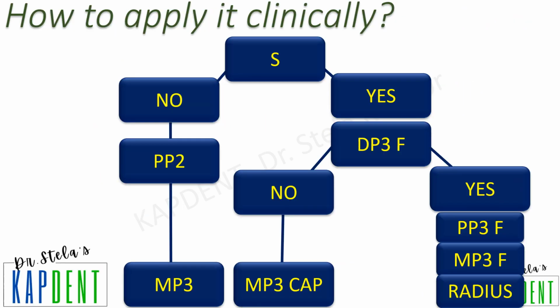At this point, or even suddenly, if you are handed a radiograph, I do not expect you to recollect all the 8 stages because it is difficult. So now here is a flow chart which is very systematic, and you may even take a screenshot of this, which you can follow to identify or assess the skeletal age.